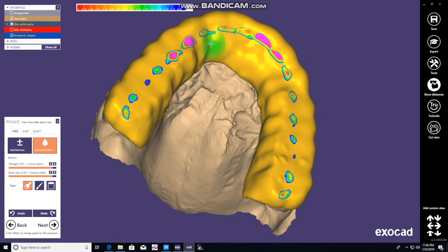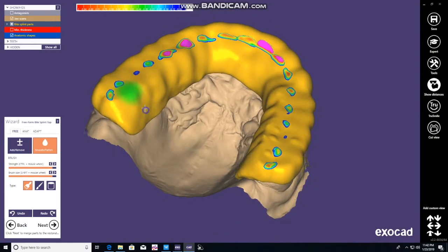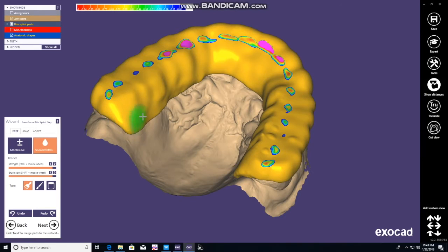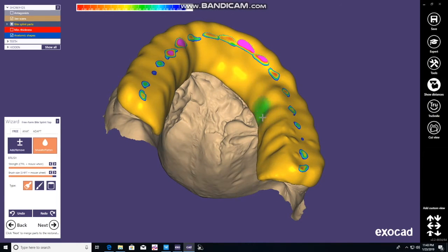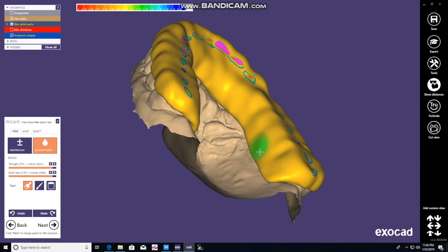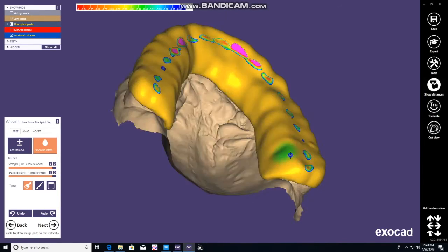Here especially we do quite a bit of smoothing. This is where their tongue will be less uncomfortable if you can smooth this out. You'll start to see it starting to look more like a night guard. If you need to, you can flatten it — and that's holding Shift down. You'll see the button change colors, or the area highlighted by the mouse would change colors if you use Shift. I think we're using the flatten button there.